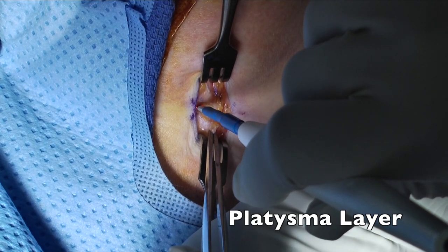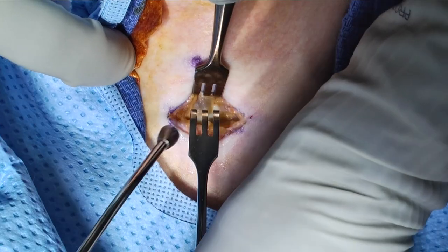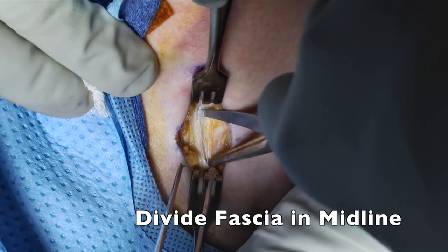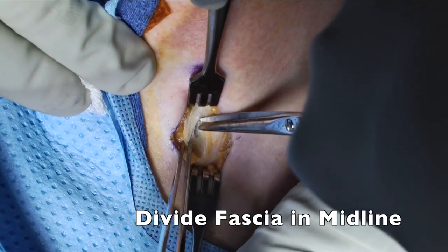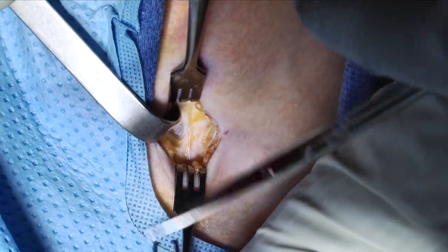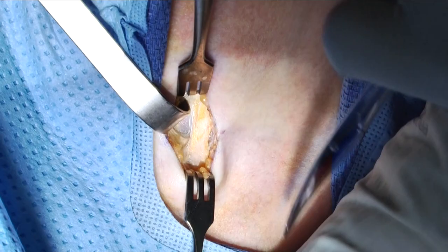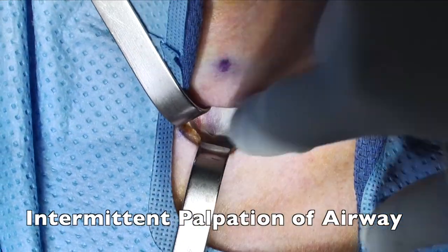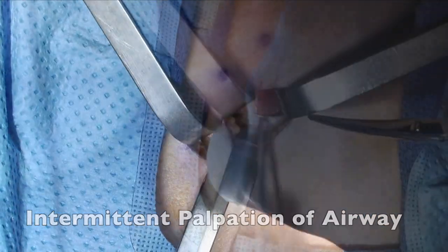The platysma layer is identified and divided using cautery, and this tissue is retracted using retractors in this case. Subsequently, fascia is divided in the midline using a Jones scissor and retractors are inserted. Intermittent palpation of the airway at this point is very important, as it is very easy to get off midline.